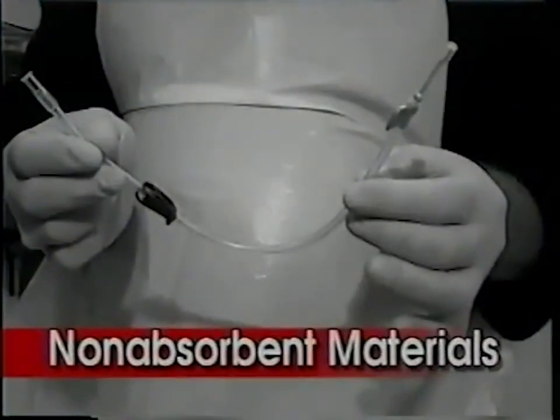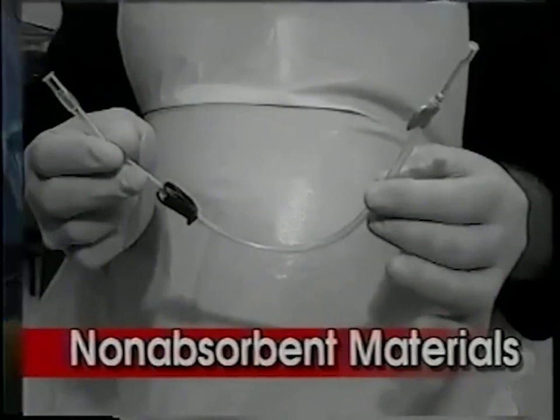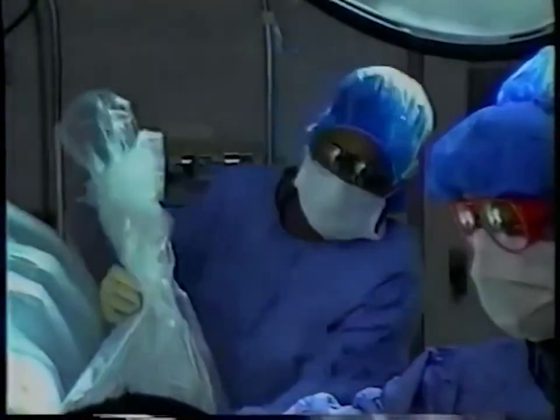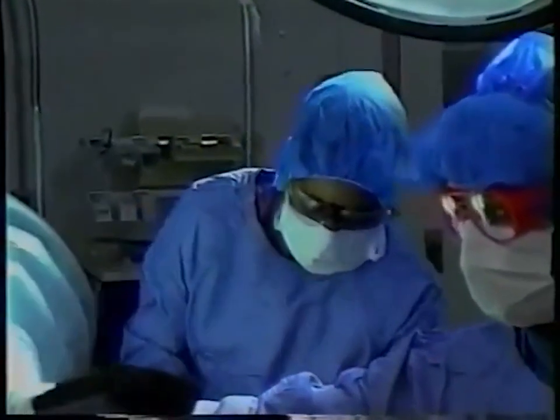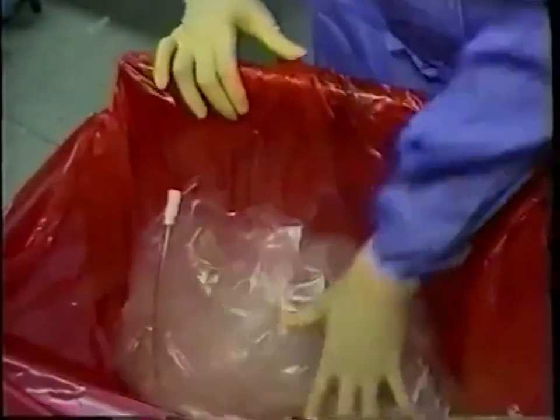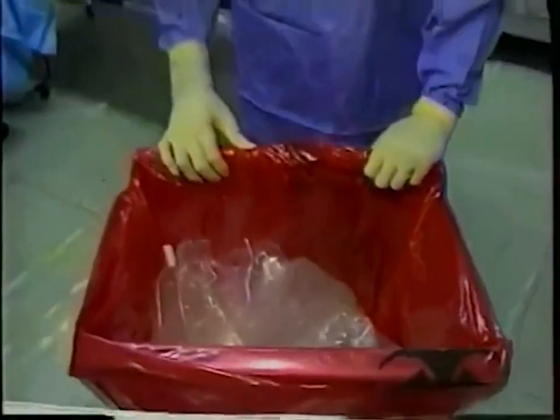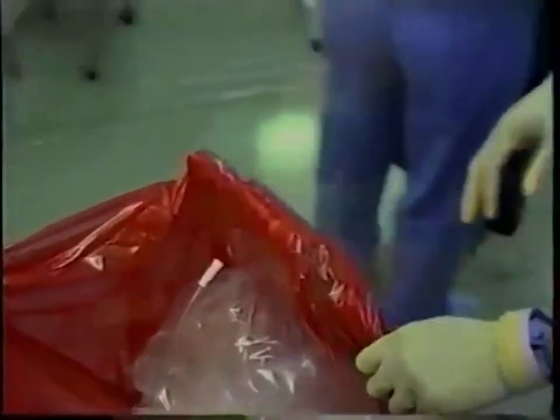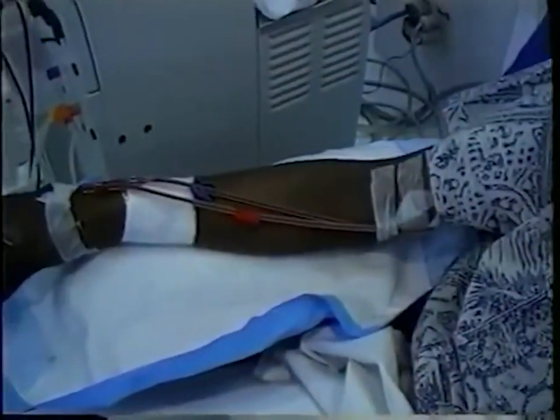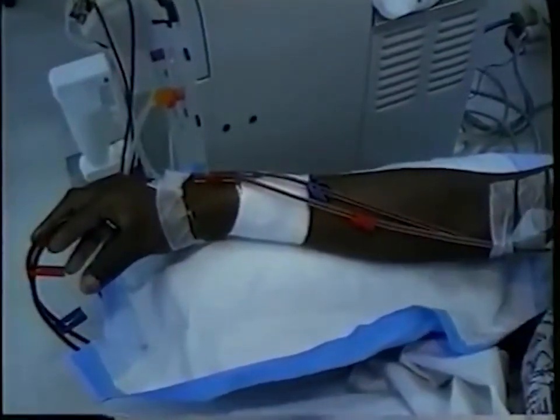The code also includes as biomedical waste non-absorbent disposable devices, such as this disposable plastic surgical drape being taken down by the nurse, that have been contaminated with blood, body fluids, or blood-contaminated secretions or excretions, and have not been sterilized or disinfected by an approved method. A non-absorbent device would be a pair of gloves, an IV tube, a urine specimen cup, if it were to have secretions with blood in it, etc.